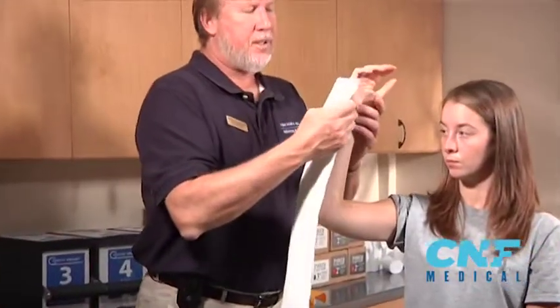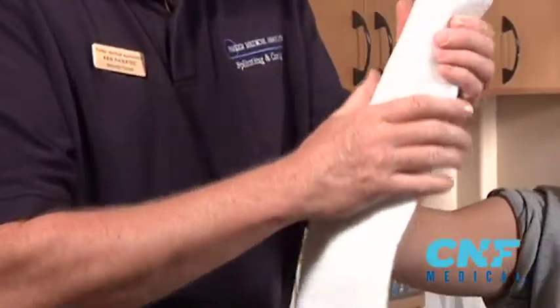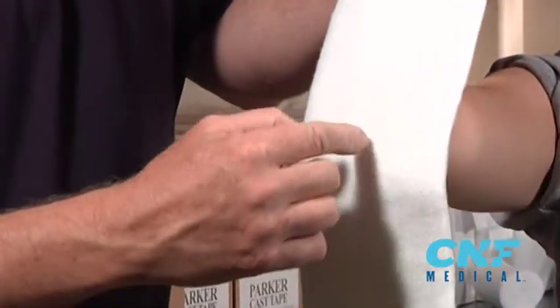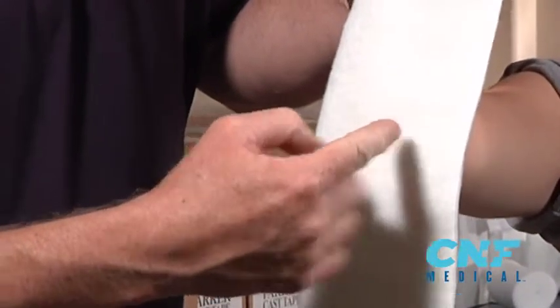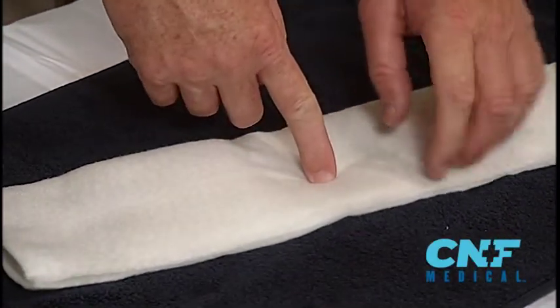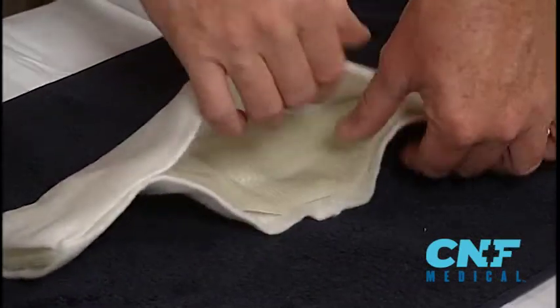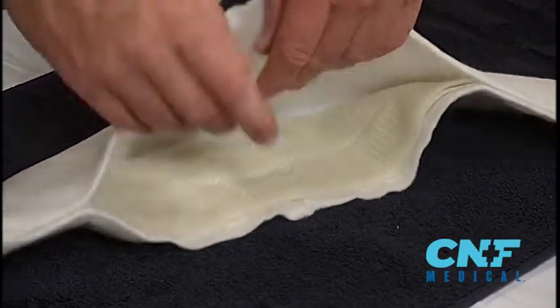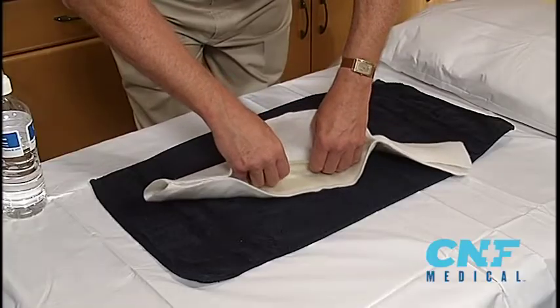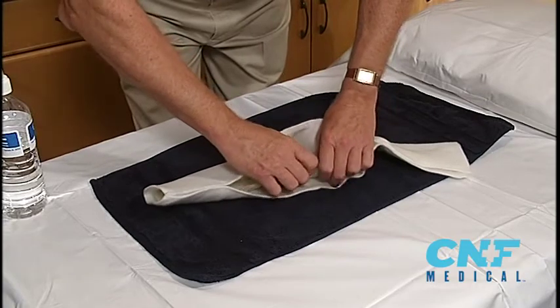Press it back on your patient. Now right here at the elbow, make a little pinch. You can mark this with a pen, or just pinch it with your finger here. Now, remembering the double face tape, I'm going to open this up. This is a different technique unlike the conventional where you just have dog ears. I'm going to fold back my fiberglass — this side to the center seam, and this side back into the center seam, just at the elbow.